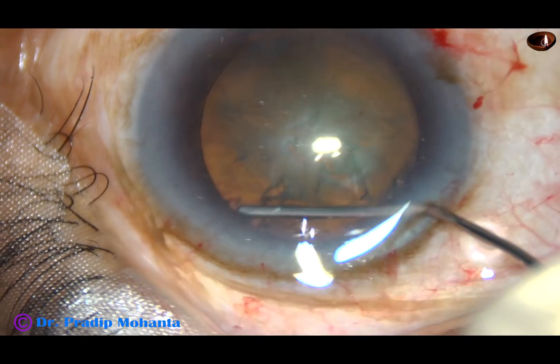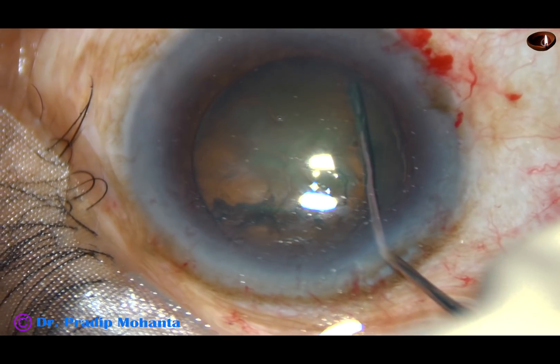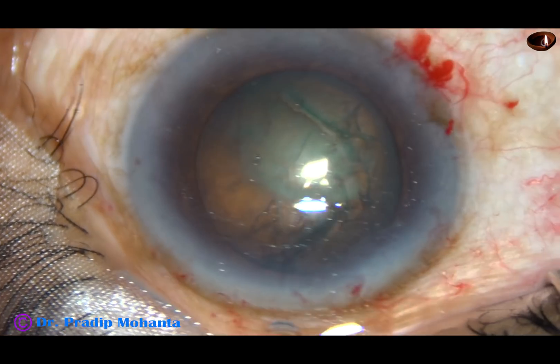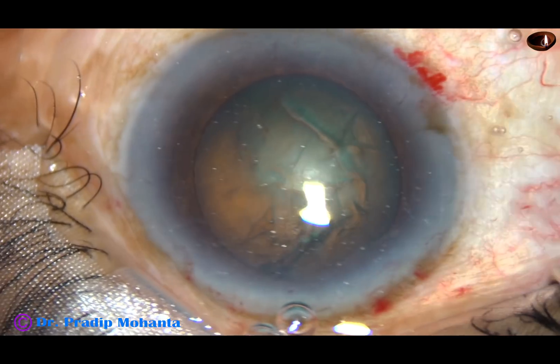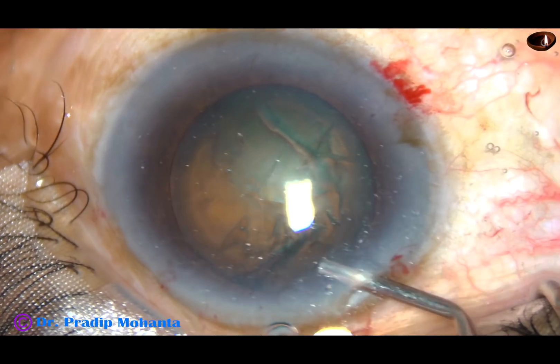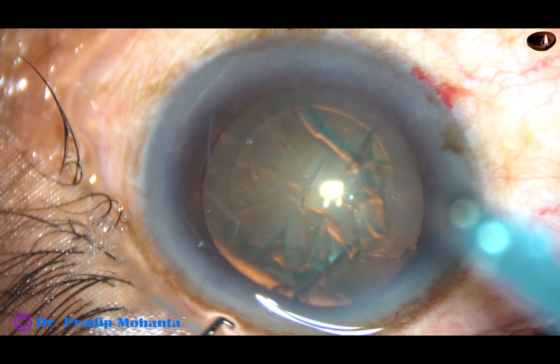Hydrodissection is done. Hydrodelineation is also attempted. We can see that the nucleus rotates very nicely. Visco is again injected and now is the time to introduce the tip of the FACO handpiece.